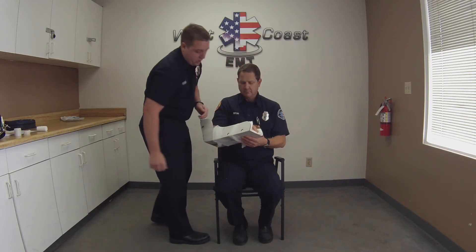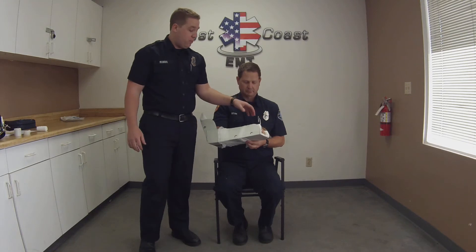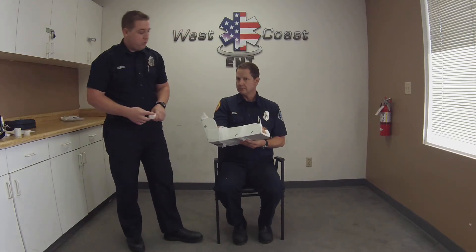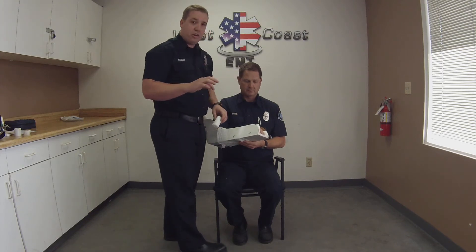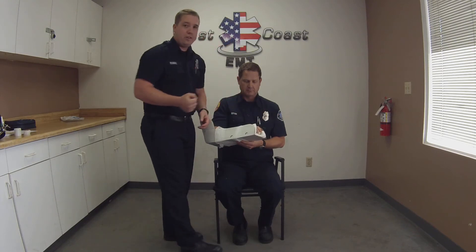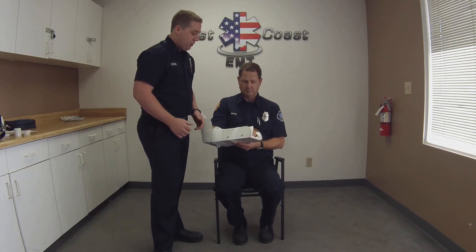Another key point is I want to make sure I'm splinting the extremity in a position of function. Basically that means splinting it so the patient can still have function of their distal parts — in this case, the hand. Having the patient hold on to a roll of gauze helps ensure that is achieved adequately.